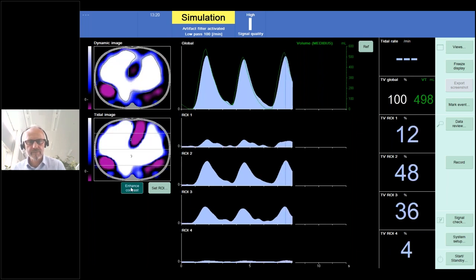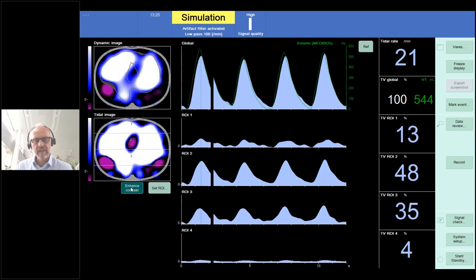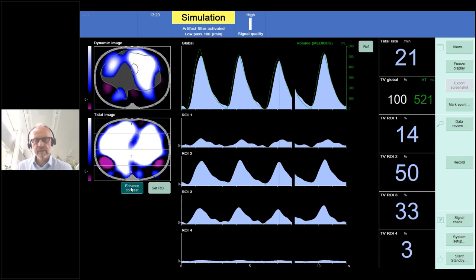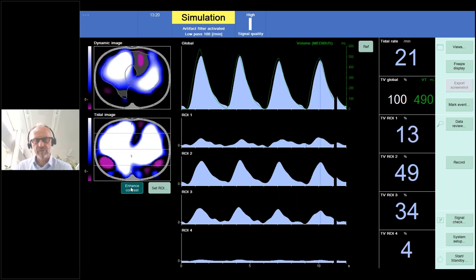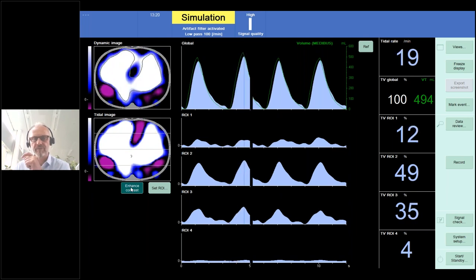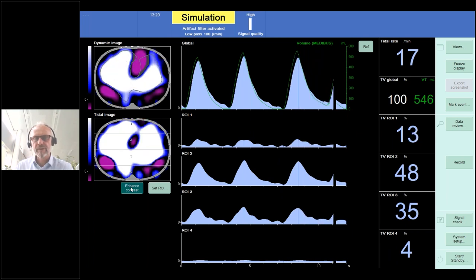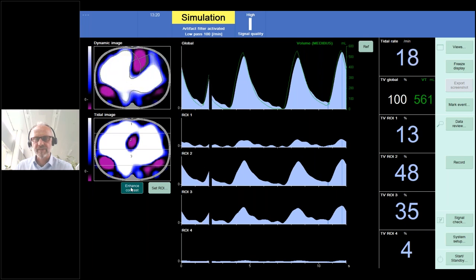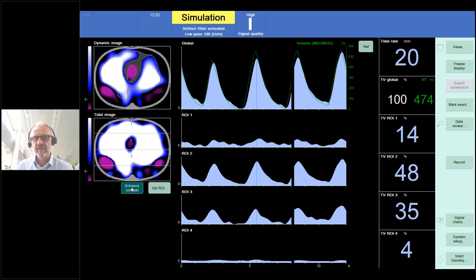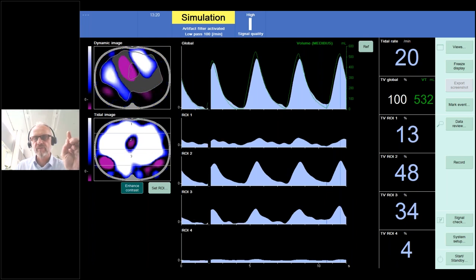Just a second. Okay, now I keep it pressed. You can see in the dorsal right lung a large purple region. So that is pleural effusion, but also in the left dorsal lung, you see those purple spots. They are also indicating and suggesting pleural effusion. What you also see in the ventral part is actually the fluid contained in the mediastinum. So we see the same effects that are caused by pleural effusion also in the mediastinal part, either through aortic movement or the heart itself.